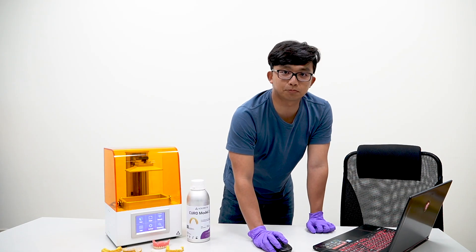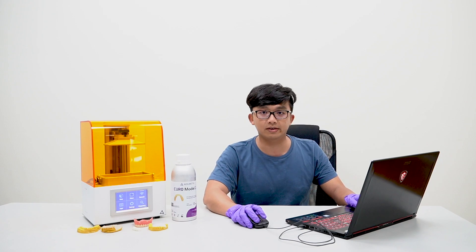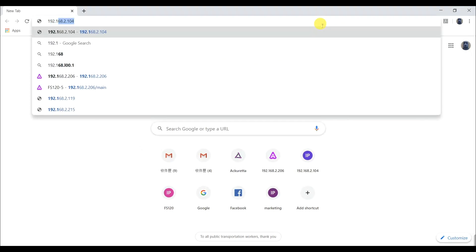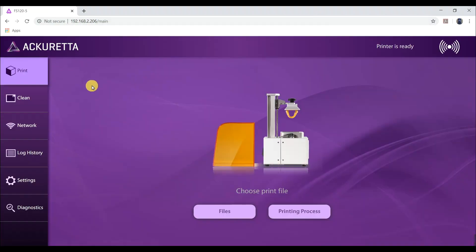Our file is ready — let's print! By the way, if you are a frequent printer, drain your vat completely every two weeks, or do it once a month. Change the vat film if you see dents or if it is no longer transparent. Open the web browser and key in the IP address for the printer.